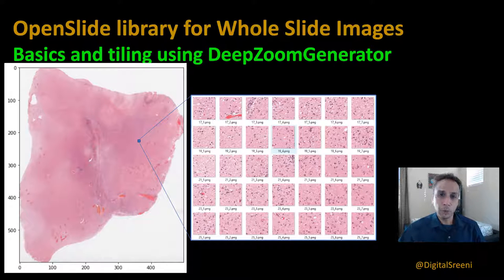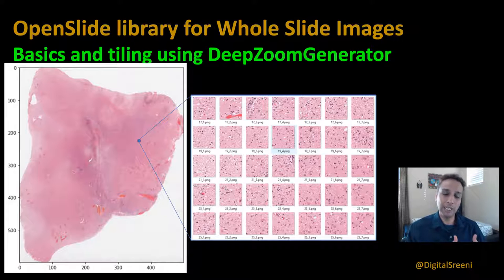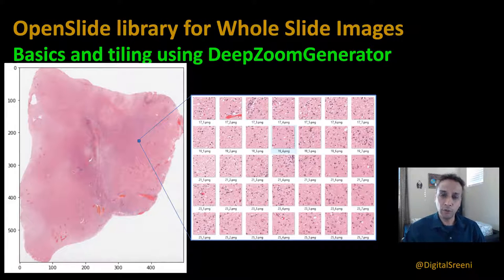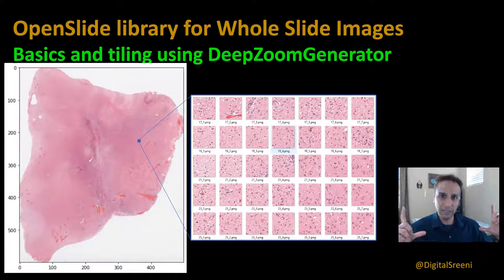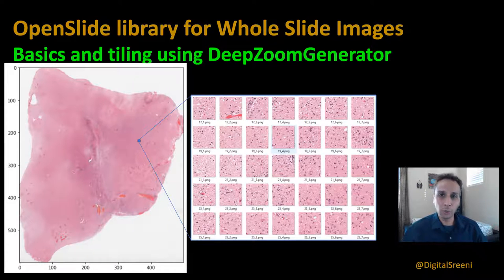When covering those topics, we learned how to read multiple files and apply a task — like Gaussian denoising — to a folder of images or a TIFF stack. A question I often get is: how do you process a whole slide image? A whole slide image is a very large image, hundreds of thousands of pixels in X and Y, and you cannot load it all into memory — you have to load it in chunks.